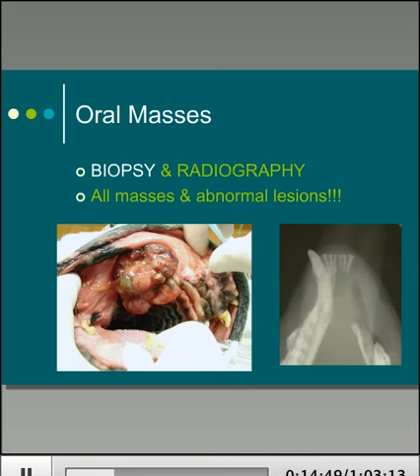But actually in this case, the vet that saw the cat thought that they had a mobile canine, and the tooth that's now gone was a canine. As you can see, it's now gone. They removed it because they just thought it had periodontitis. As soon as you do an x-ray, you see that tooth was wobbly, not because of periodontitis, but because it sat within a neoplastic mass. So again, prognosis really changes, and obviously so does, unfortunately, the fate of the cat. But a radiograph makes it obvious, whereas clinically you wouldn't have thought there was that much going on with a cat.